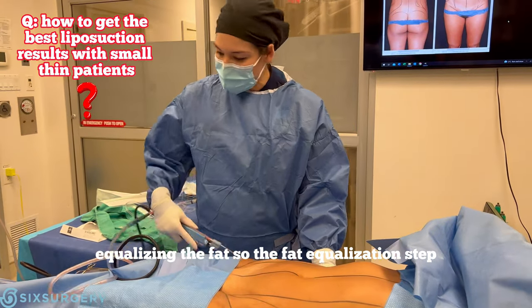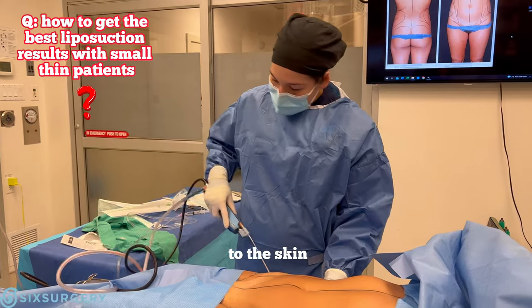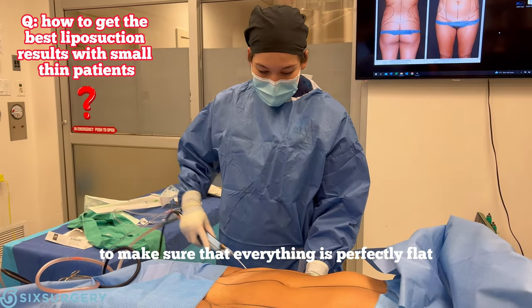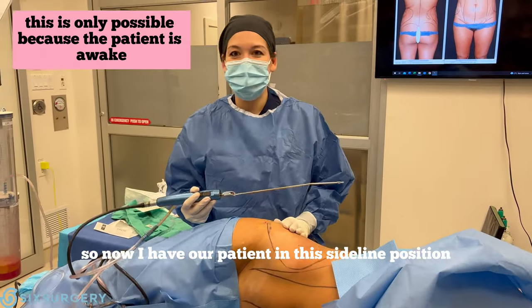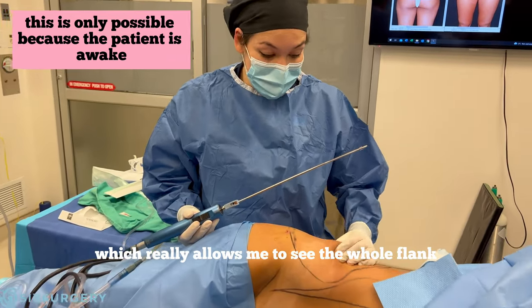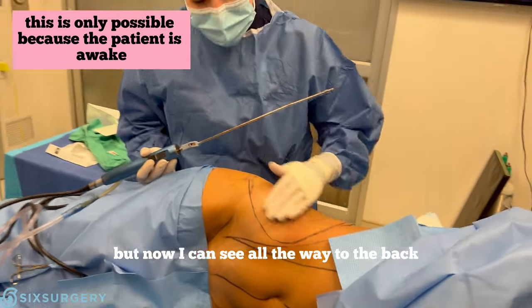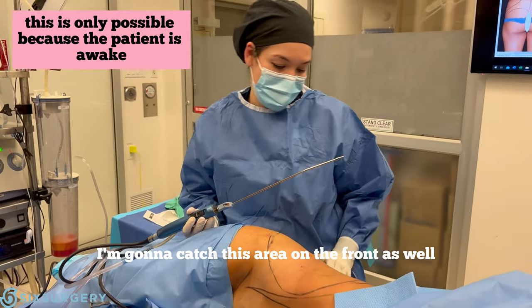At the end I'm going to spend a lot of time just equalizing the fat. That fat equalization step creates the smoothest contour — it allows me to get really close to the skin to make sure everything is perfectly flat. Our patient is in this side-lying position, which lets me see the whole flank and make things nice and thin, all the way to the back. I'm going to catch this area in the front as well.